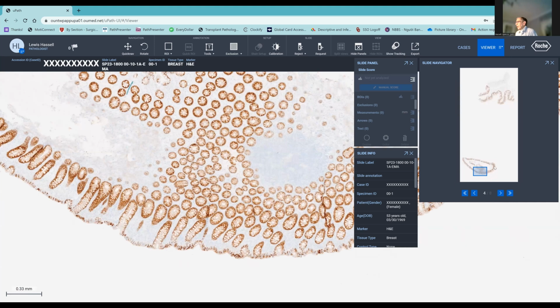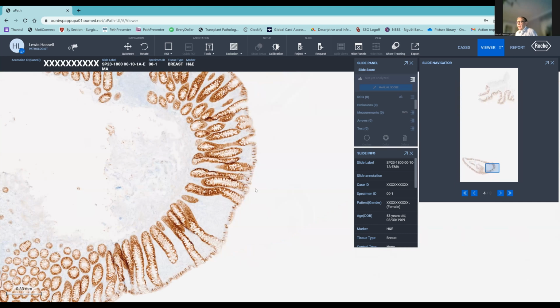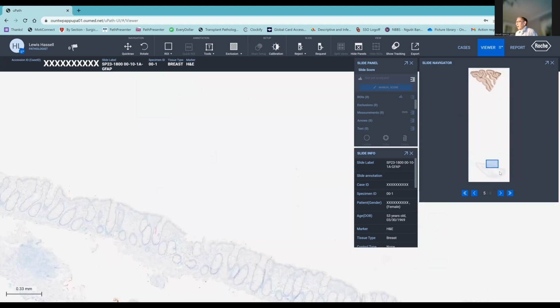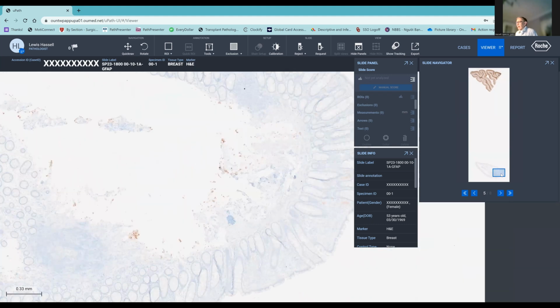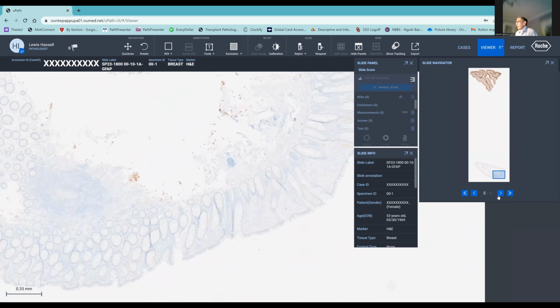And here we'll go to the area in question. And you'll see that, again, the lamina propria is expanded, but it's not with anything that stains with keratin or EMA. And here, the stain with neurofilament, GFAP, just to rule out anything that might contain neurons, such as ganglioneuroma or perineurioma, and that also is negative.